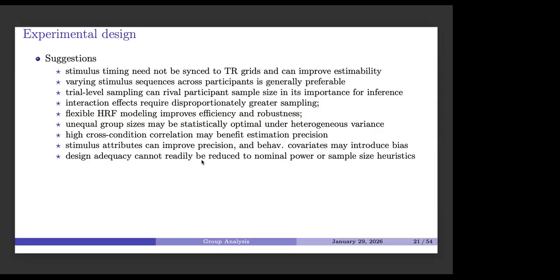Why? Because an FMRI study is so complex. There are so many components involved, such as modeling, covariates, right? So the different pipelines. As for the tools available in the field, there are a couple of them, but in reality, I don't think people use them when they design an experiment. Only if they are forced when they submit a grant. That's probably the case. So my point is, power analysis in FMRI is not totally useless, but it's not really useful. So that's all I want to say about experiment design.